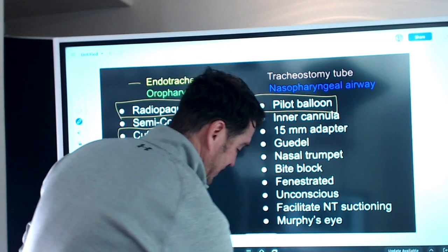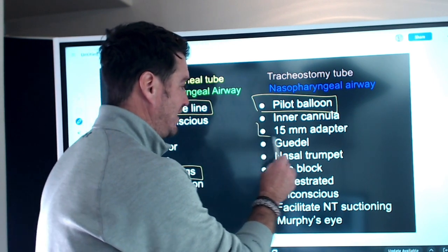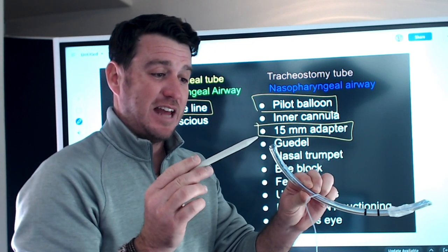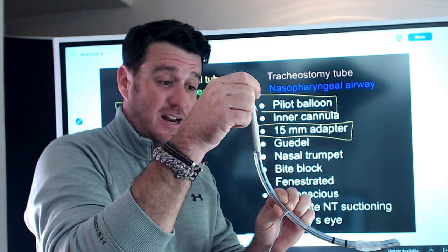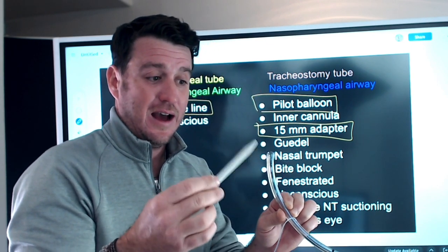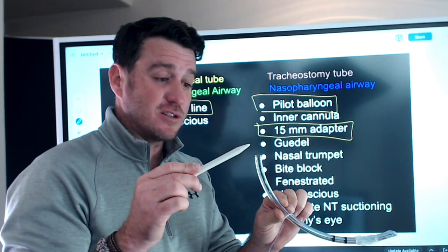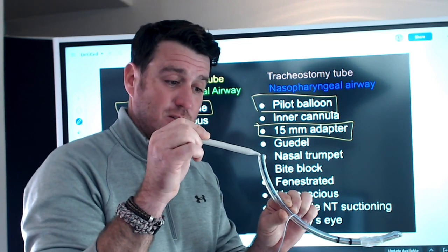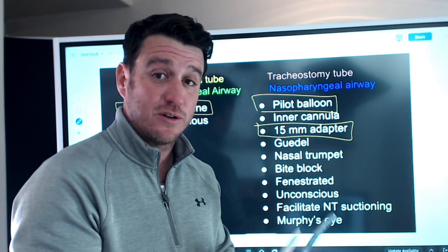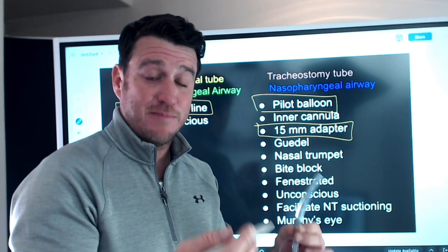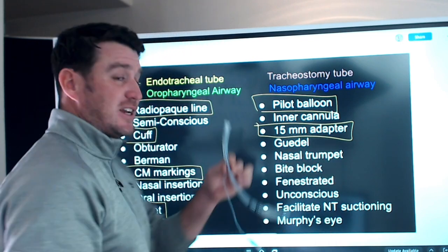Inner cannula — this endotracheal tube does not have an inner cannula, so no. 15-millimeter adapter — 100% yes. The 15-millimeter adapter fits into the end of the endotracheal tube. It's used to connect to a ventilator circuit to provide positive pressure ventilation, or during manual bag-valve-mask ventilation. When bagging a patient with an endotracheal tube, you connect to the 15-millimeter adapter. It 100% goes with the endotracheal tube.